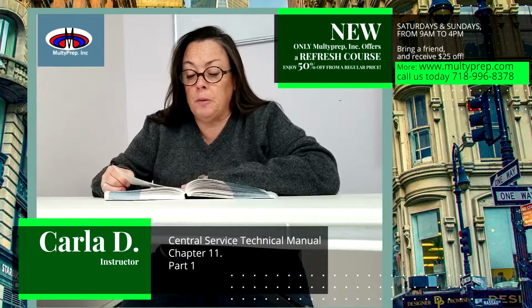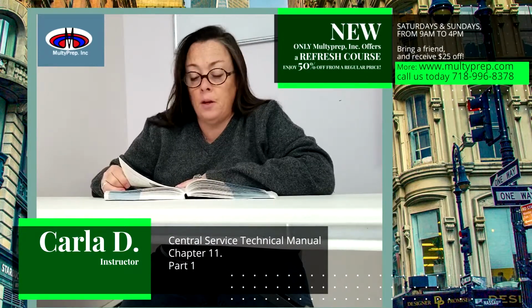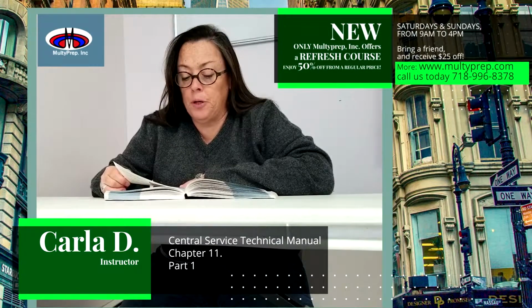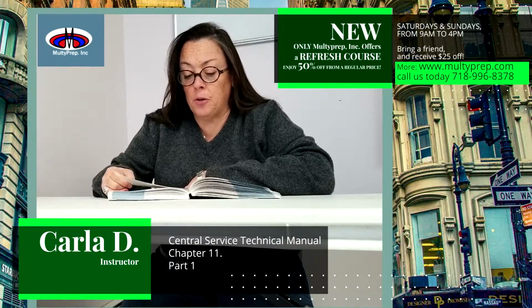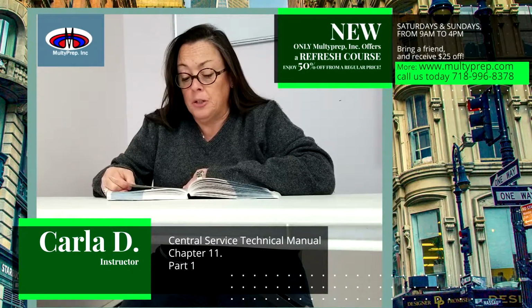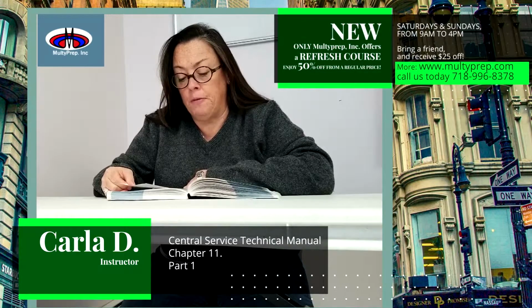Figure 11.1 shows some internal components of a motorized handpiece and demonstrates the complexity of powered surgical instrumentation. Powered surgical instruments contain several working components that will be damaged if fluid, such as water or cleaning solution, is allowed to penetrate into the device's interior. Figures 11.2 and 11.3 illustrate the type of damage that occurs when powered surgical instruments and their accessories are invaded by fluid. CS professionals should be specifically trained to clean, process, and handle powered surgical devices and equipment and ensure that fluid invasion doesn't occur.